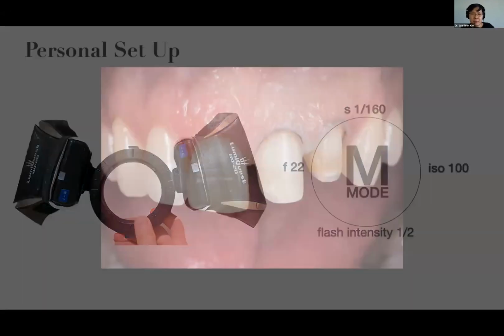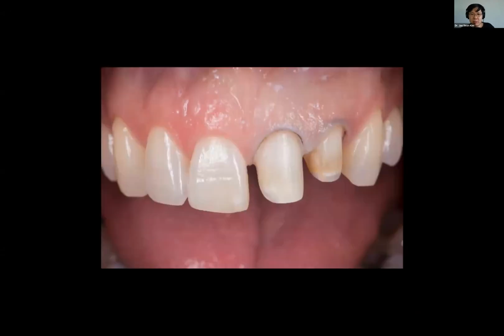And here are some examples. This prep that I took with this bouncer. And this is an indirect light. So the flashes are not coming directly at the object, but it's actually going into the bouncer pocket, and it's basically raining light down on the subject. So it's indirectly illuminating the subjects.